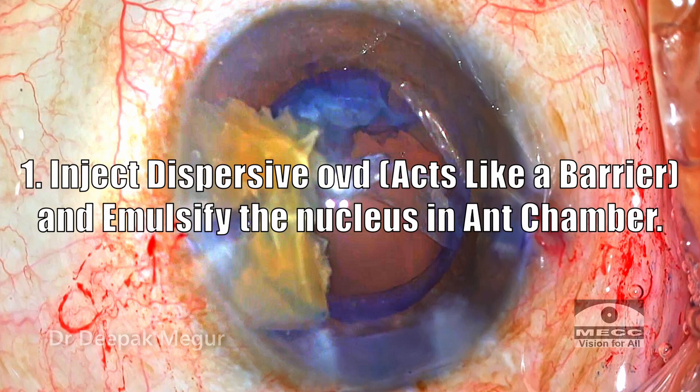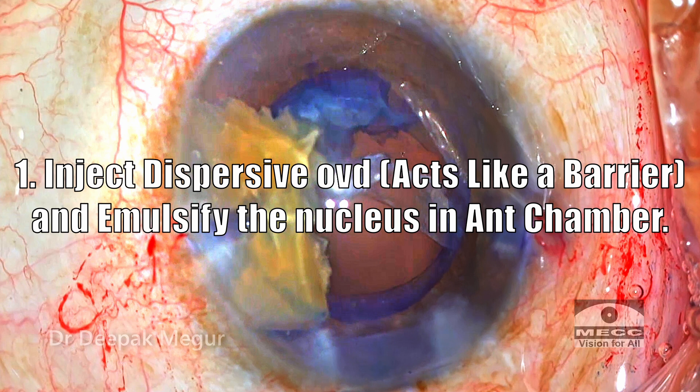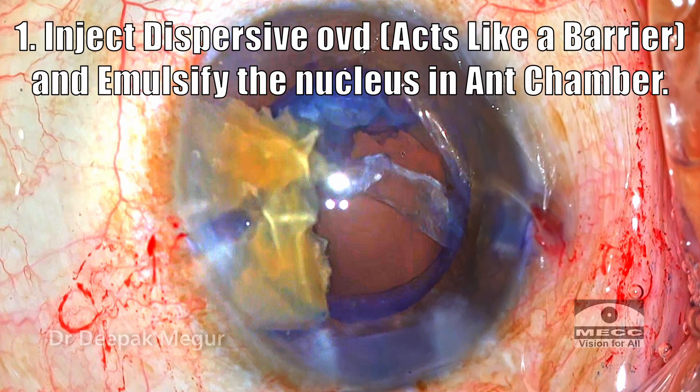I decided to go with option one — emulsifying these fragments in the anterior chamber under the cover of dispersive OVD. The reason I chose this option is that the anterior hyaloid face was still intact and the dispersive OVD would provide adequate barrier, allowing me to finish the job quickly. I didn't choose the IOL scaffold at this stage because removing the epinucleus under the intraocular lens could become a little tricky. That was my concern.